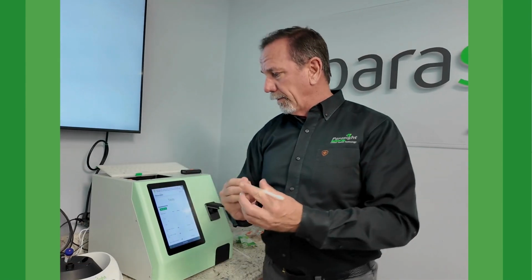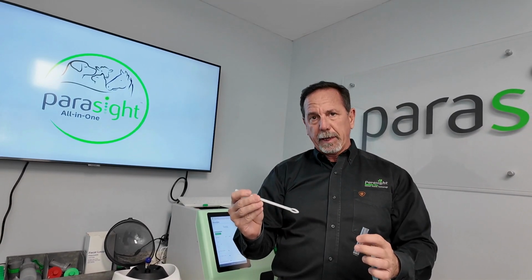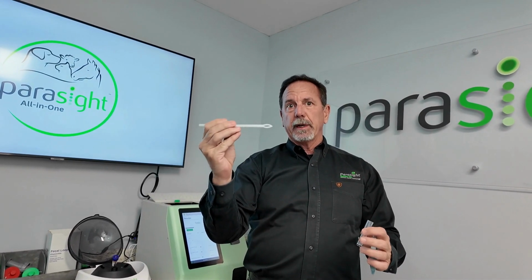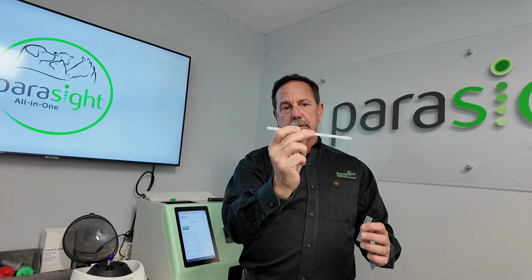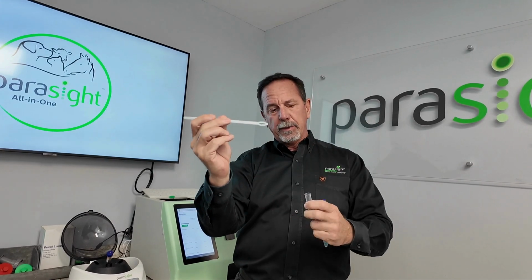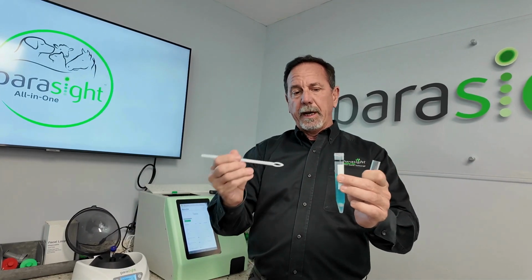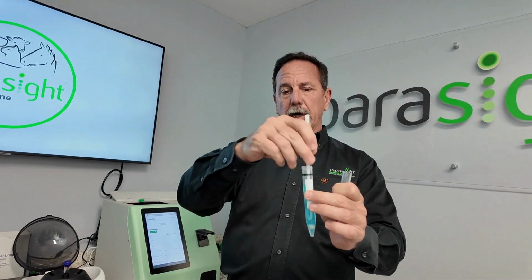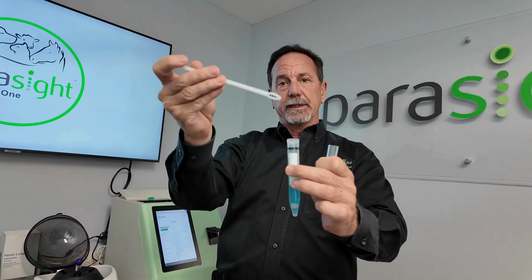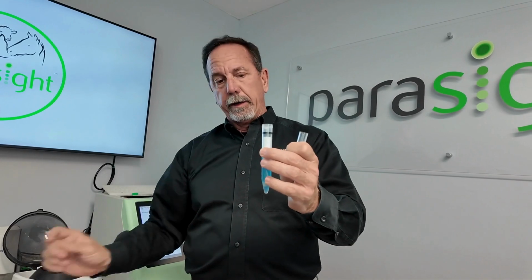So I'll go through that for you one more time of what you'll need to be able to do there, to remind everybody how to prepare a specimen even using a fecal loop for an example. Remember that this is put into the animal's anus, spun around, and a small part of the fecal sample will be caught in the loop. What you'll do is you'll take that, you'll open up the tube here with the fecal flotation solution in there. You'll go in there and you'll shake that and liberally move that so that you try to get this as clean as possible and to get all the sample as you can put into your tube.